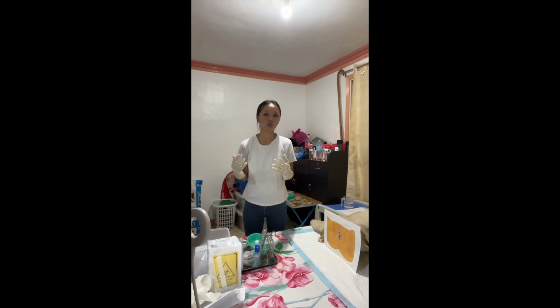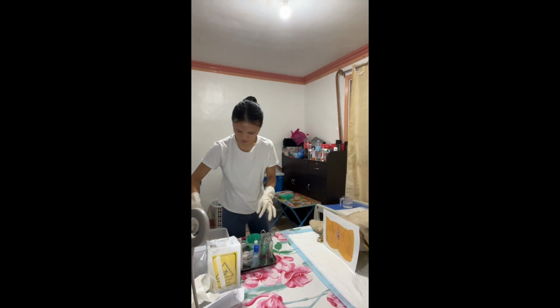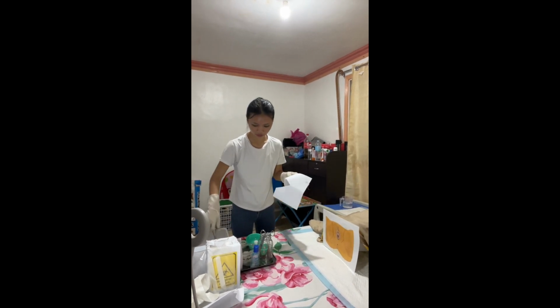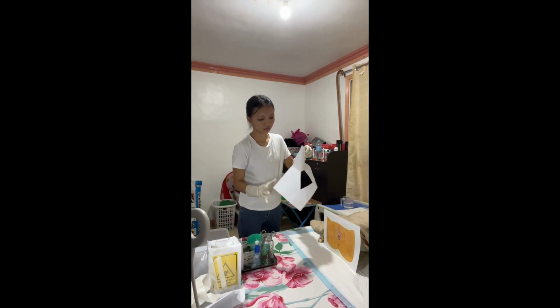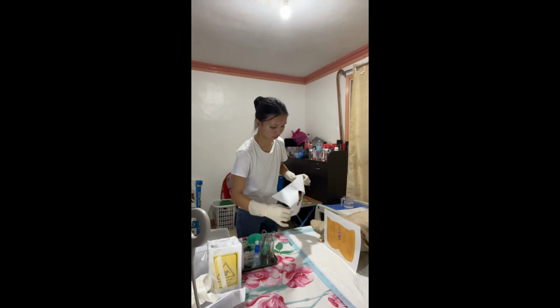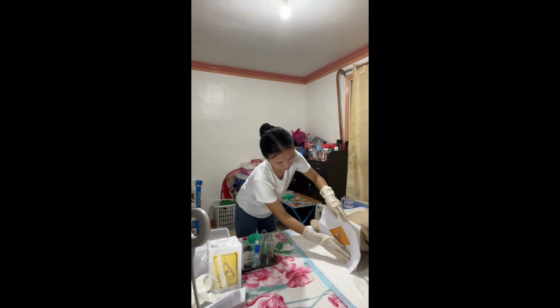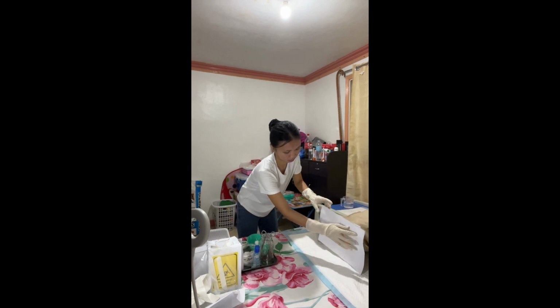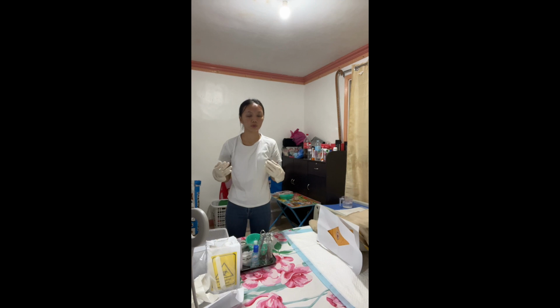The next step is to put our eye sheet to minimize the exposure of the area. And then, using our lubricant, we are going to lubricate the catheter about 1 1/2 inches, being careful not to plug the eye of the catheter.